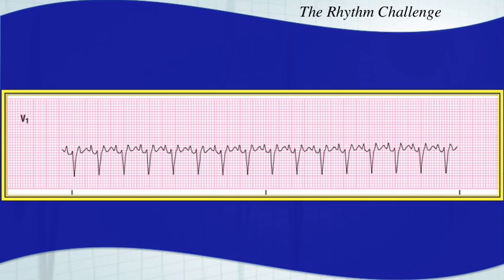This is a more difficult arrhythmia to identify. This one is another 2-to-1 atrial flutter. It looks much different than that last one. This one has a P wave just before the QRS complex and just after, all the way throughout. In fact, it's called an F-wave — flutter wave.